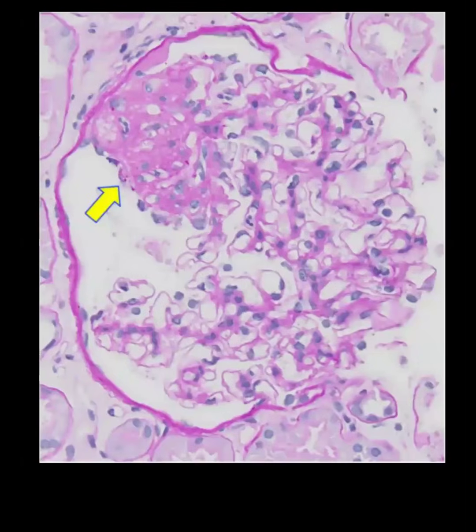So coming to this slide, which stain is it? PAS. Very nice. It is a PAS stain with a magenta color. So what is it showing actually? The segmental sclerosed area. Very nice, brother. So it is actually showing an area of segmental sclerosis.